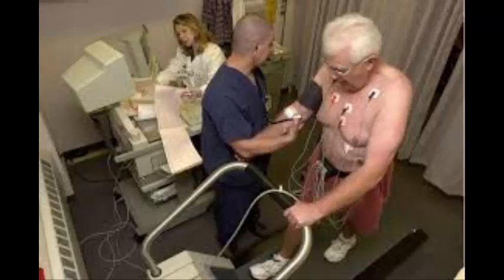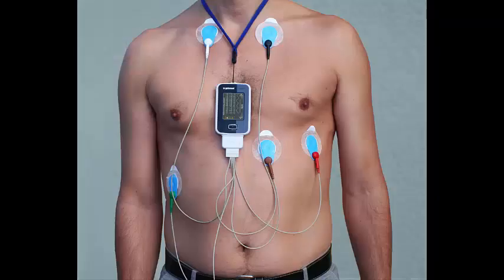Exercise testing is an unreliable population screening tool because in low-risk individuals, asymptomatic young or middle-aged women, an abnormal stress test is more likely to represent a false positive than a true positive test. Stress testing is contraindicated in presence of acute coronary syndrome, decompensated heart failure, and severe hypertension.